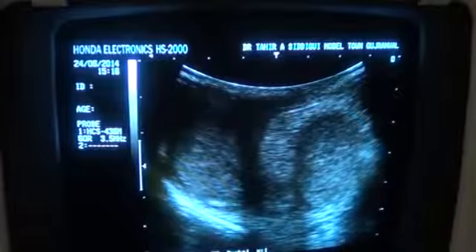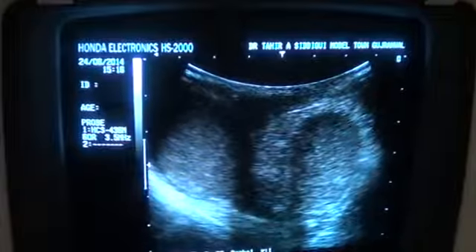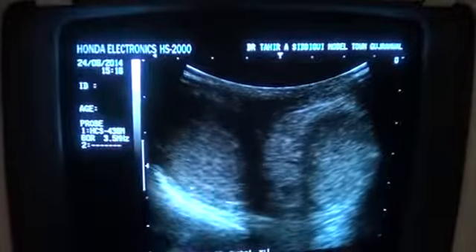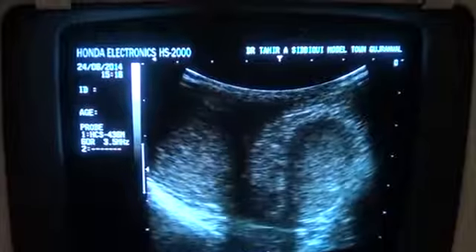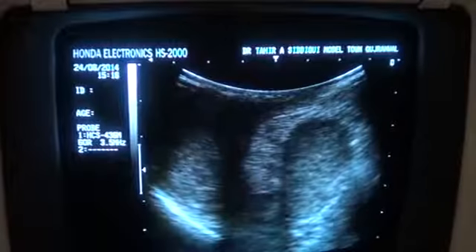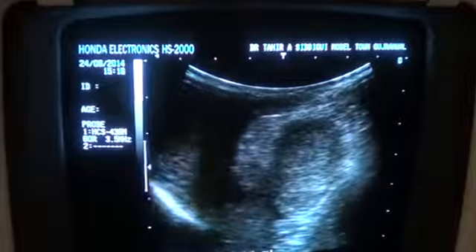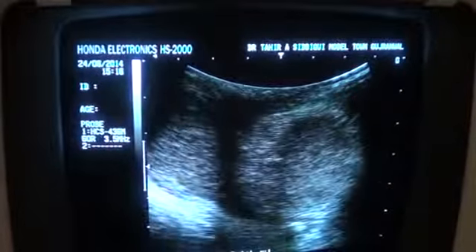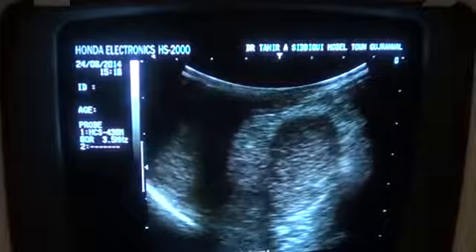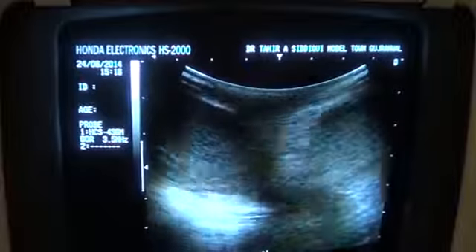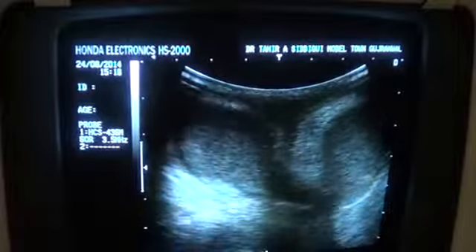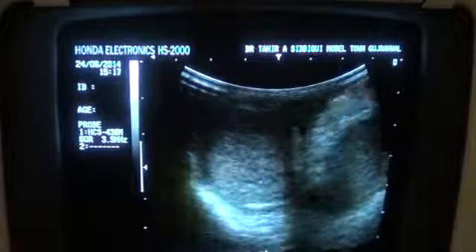This is an ultrasound study of a 20-year-old male with a history of swelling of his left testicular region.